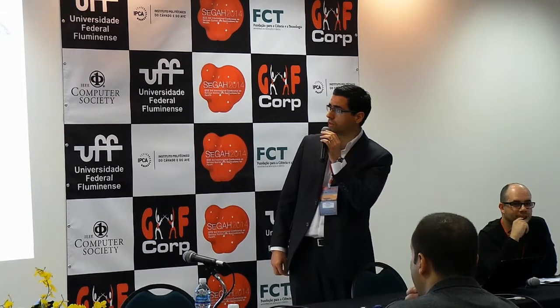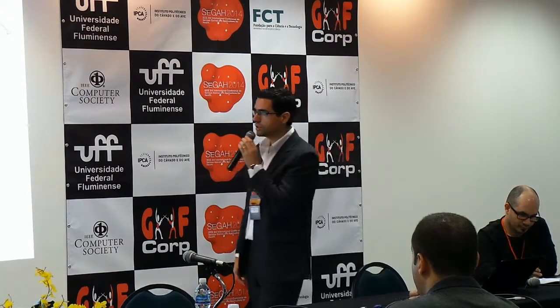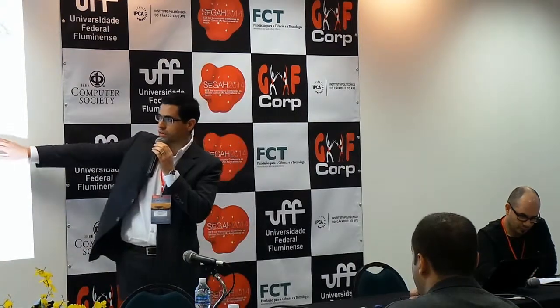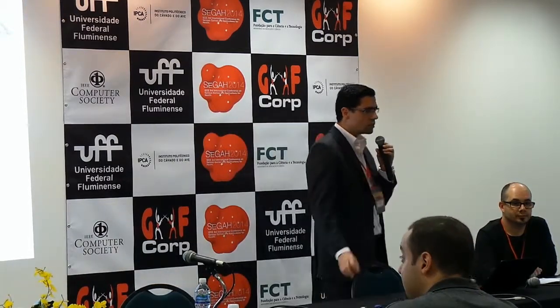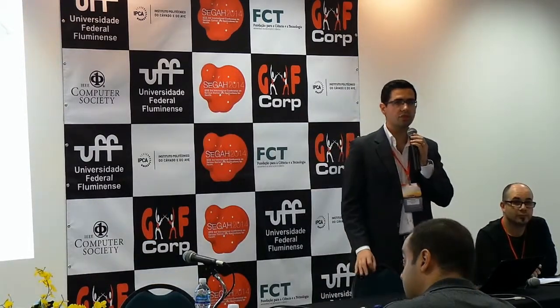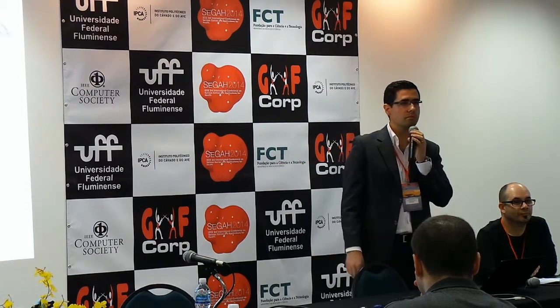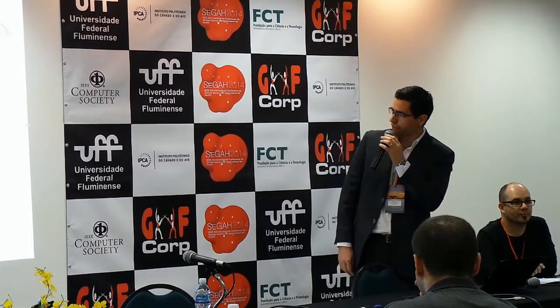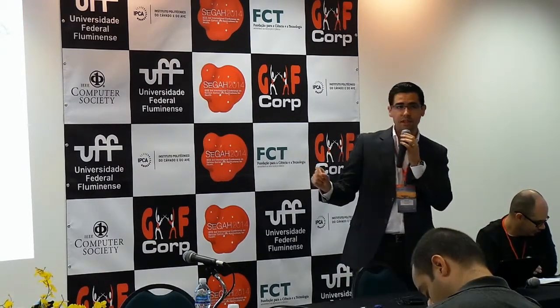Going back to the technical aspects. This is based on a single-core ARM Cortex system. The wireless communication is based on the Wi-Fi infrastructure, and it runs on a multitask Linux operating system. This central processing and transmission unit is responsible for these main four functions.